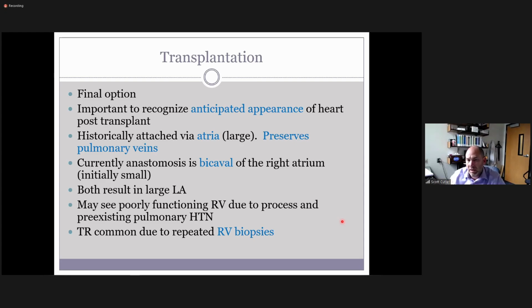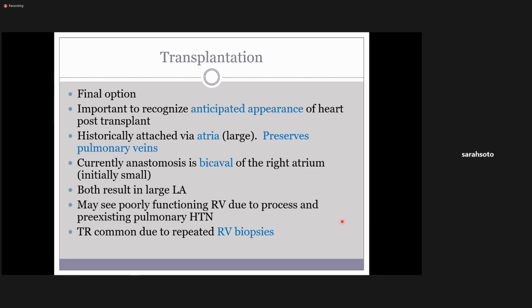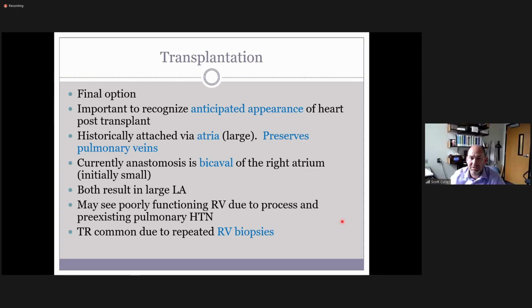So if I'm scanning a patient that has a bypass graft in the leg, we'll say, what do I want to know about that before I do the exam? Where it is. Yeah, what kind it is. What kind it is, where it attaches, all that kind of stuff. You want to know that because what do you have to do when you scan it? Follow it. Okay, you have to prove that there's flow in it. You have to prove that the opening is open.